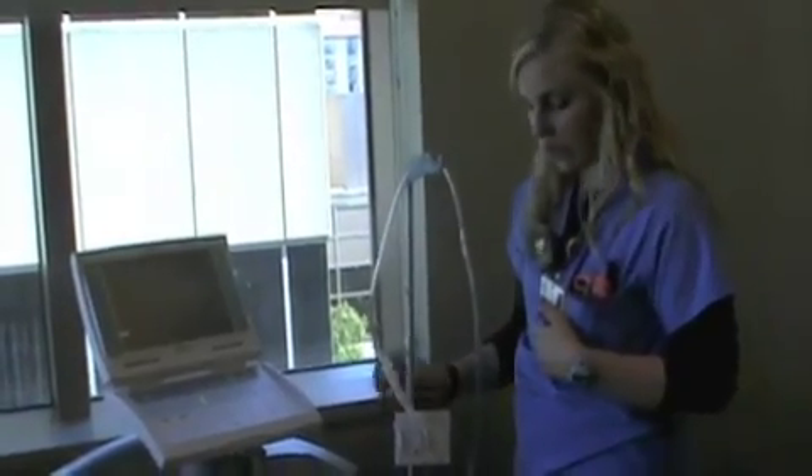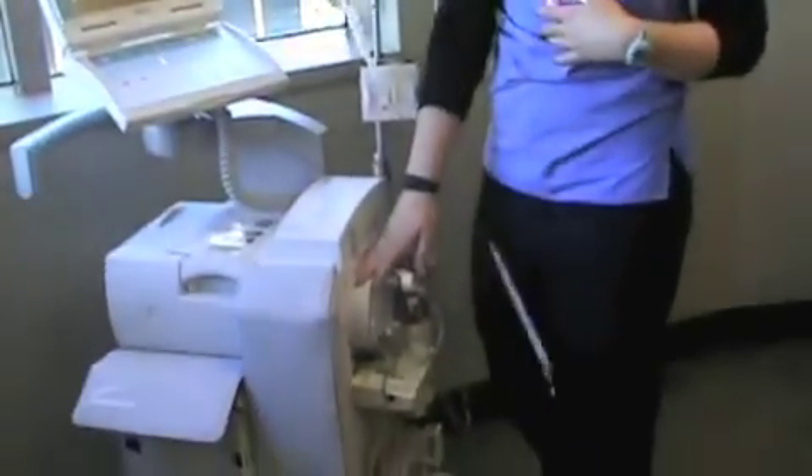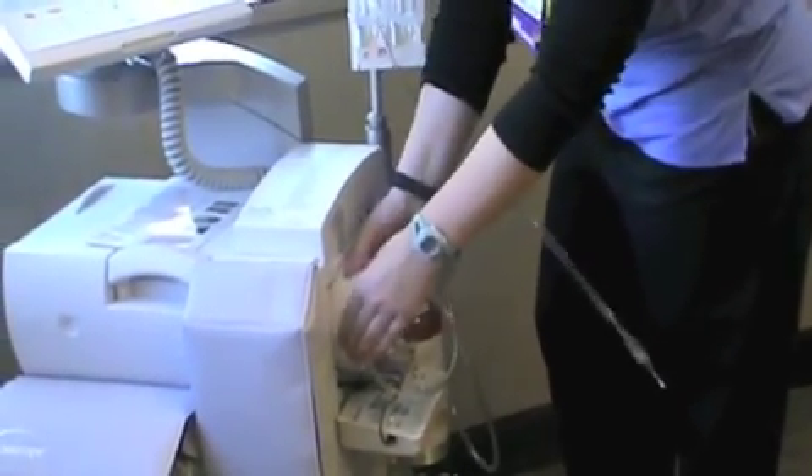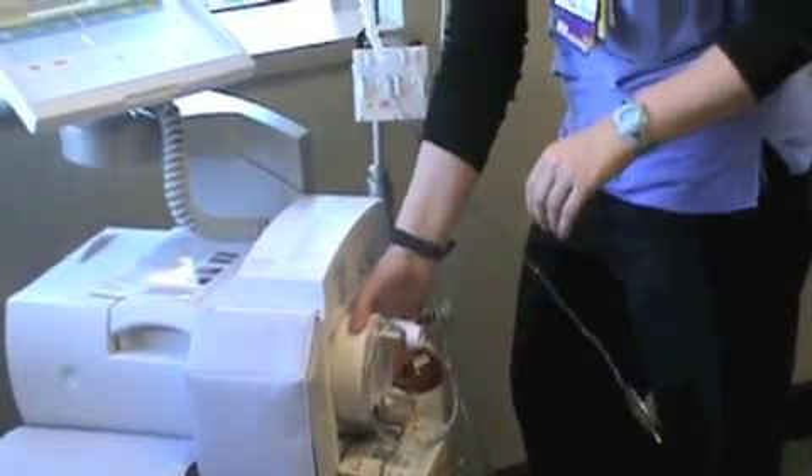The last thing you want to check for is this disc on the side of the balloon pump. Sometimes it can get twisted and turned and loose or too tight, so you want to make sure that's in good position as well.